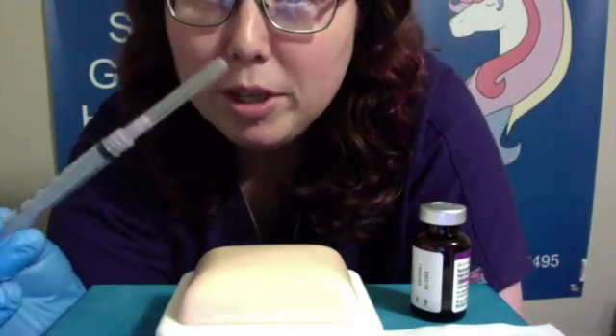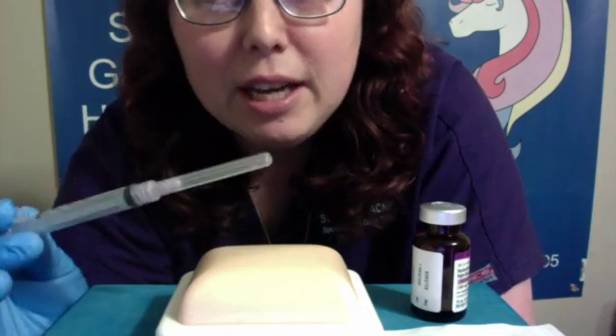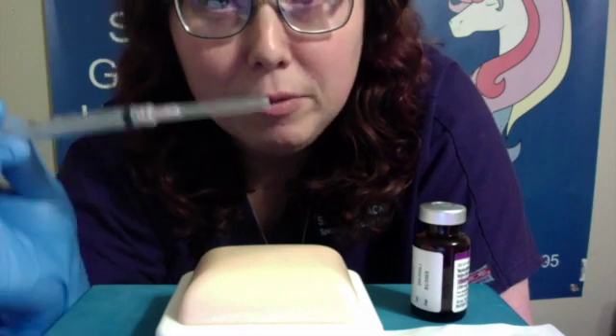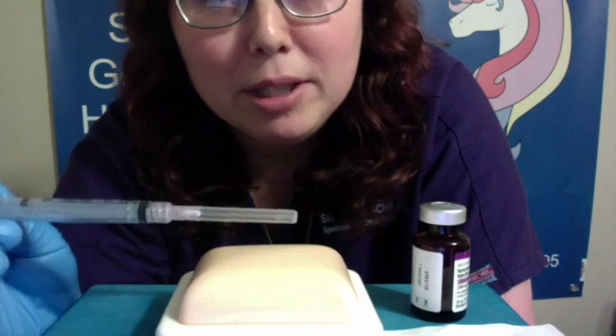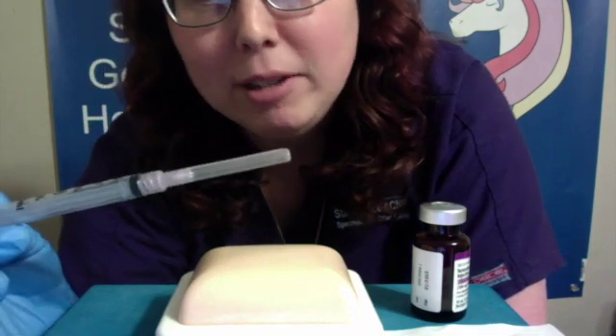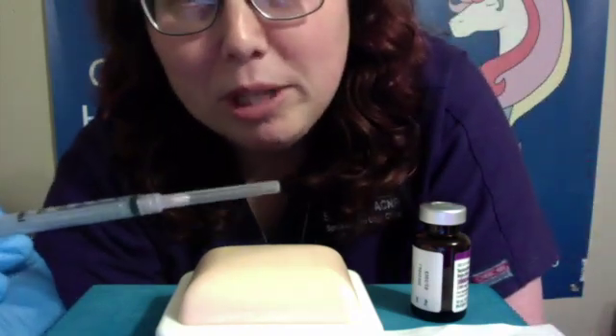This needle that I'm going to use is not anywhere close to what a subcutaneous needle looks like. This is very thick and long. It is only for demonstration purposes so that y'all can see what I'm doing, because if you couldn't see the needle — which you likely wouldn't be able to with a subcutaneous needle on this camera I have — then the technique would be a little bit lost.